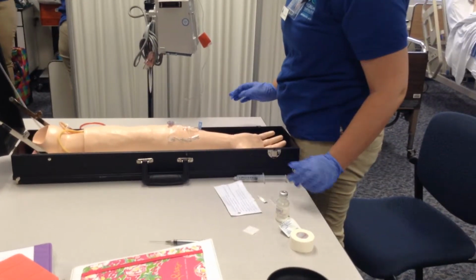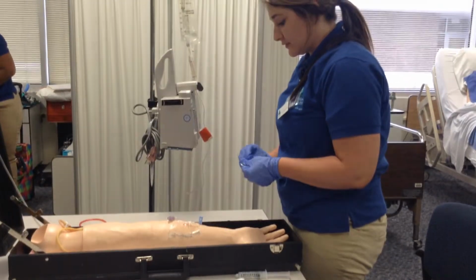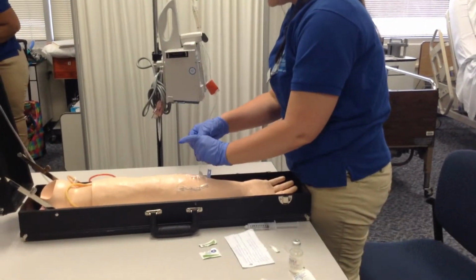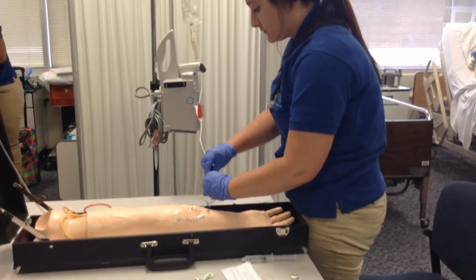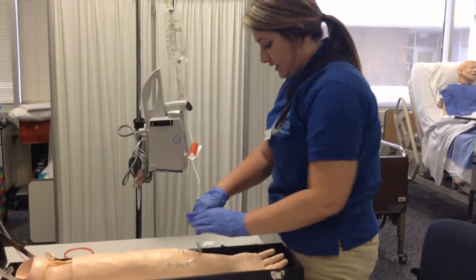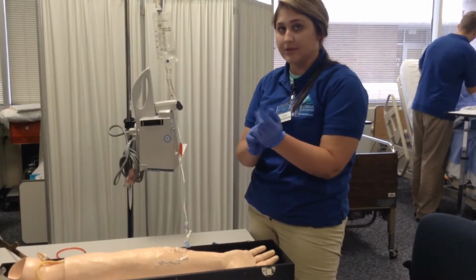I check my IV site after I clean it with alcohol. It is patent, no signs of phlebitis, inflammation, and infiltration. Of course, after I have already identified my client and reassessed for allergies and explained the procedure of the IV.